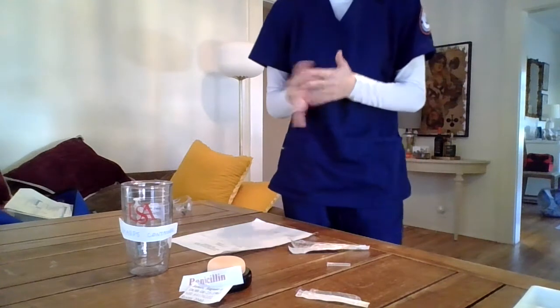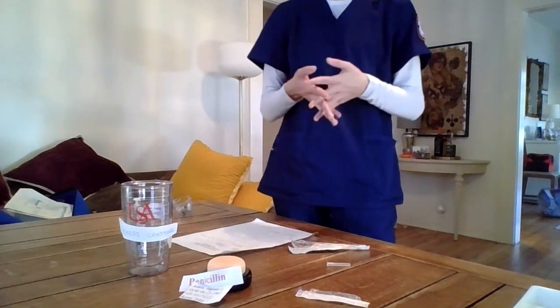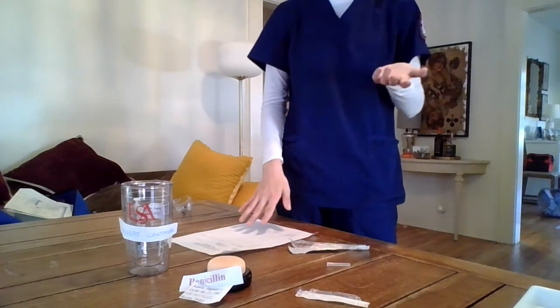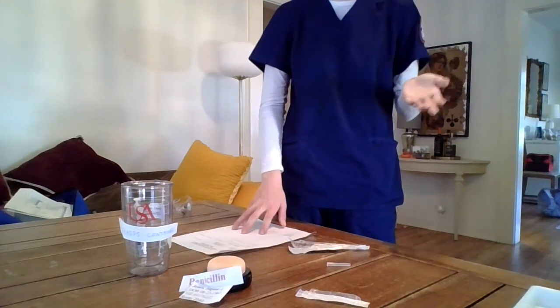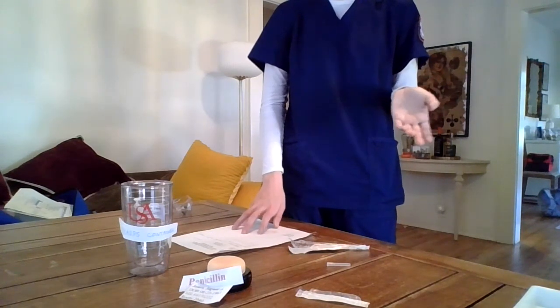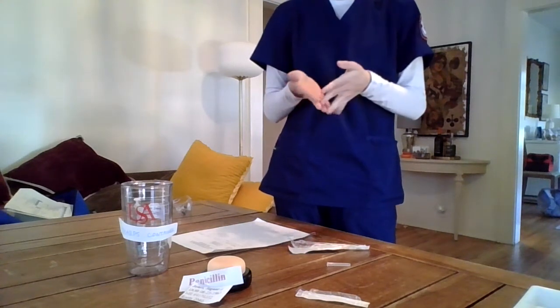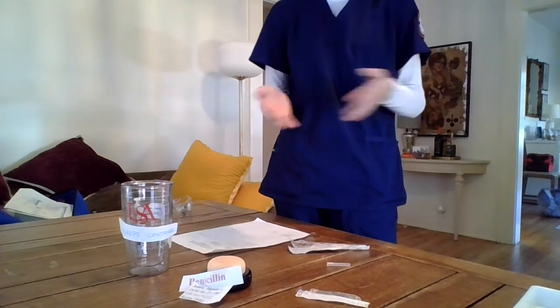So after giving my injection, I want to be sure to observe my patient for any allergic reaction. Then I would need to document the procedure on my MAR, noting the patient's response to the administration of the medication. So I'm doing this to ensure that I have properly implemented the 6th right of the patient, which is the right documentation. And after I did all this, I'll return to my patient at a later time to see how they responded to that medication and complete some medication administration checkoff.